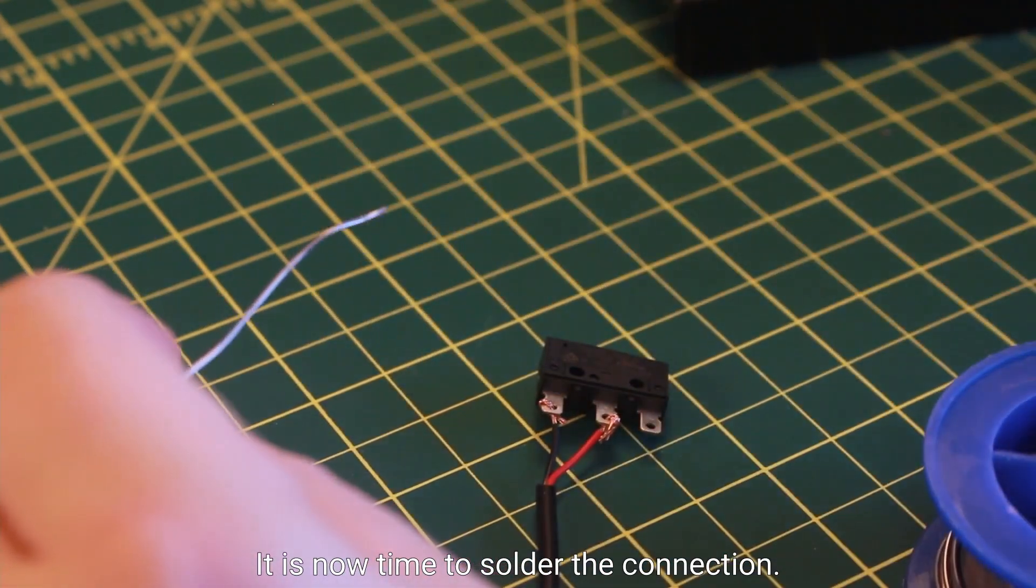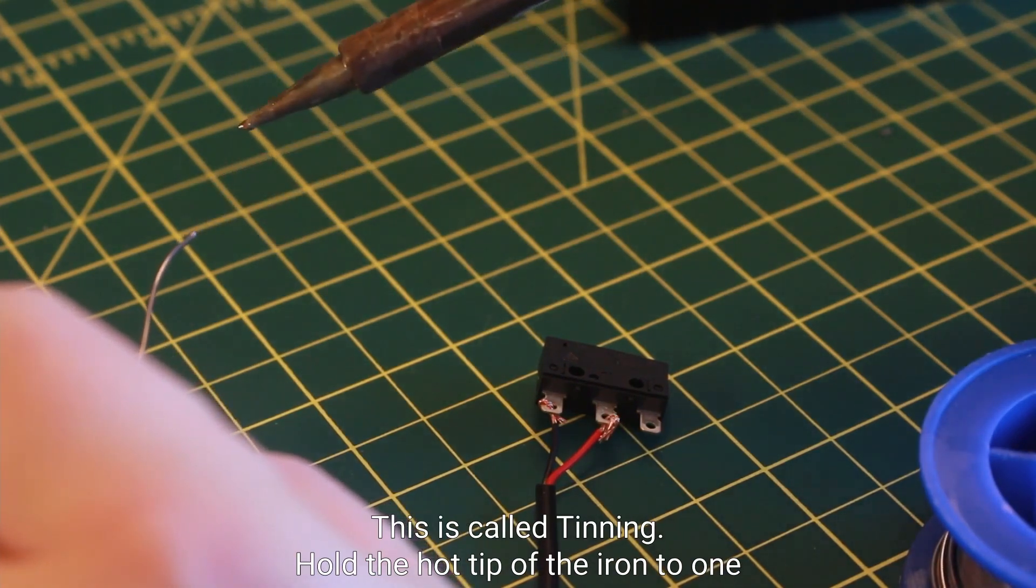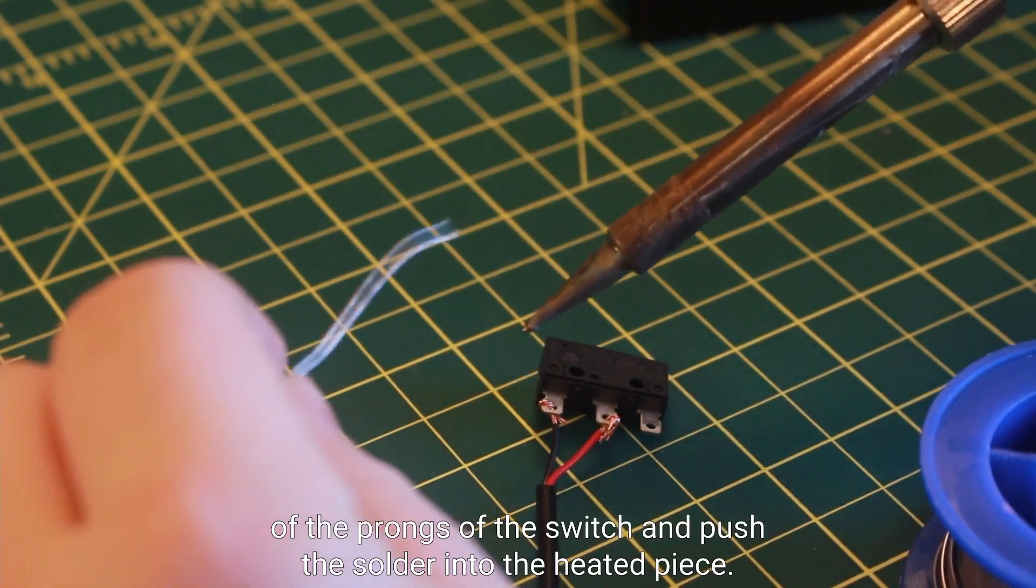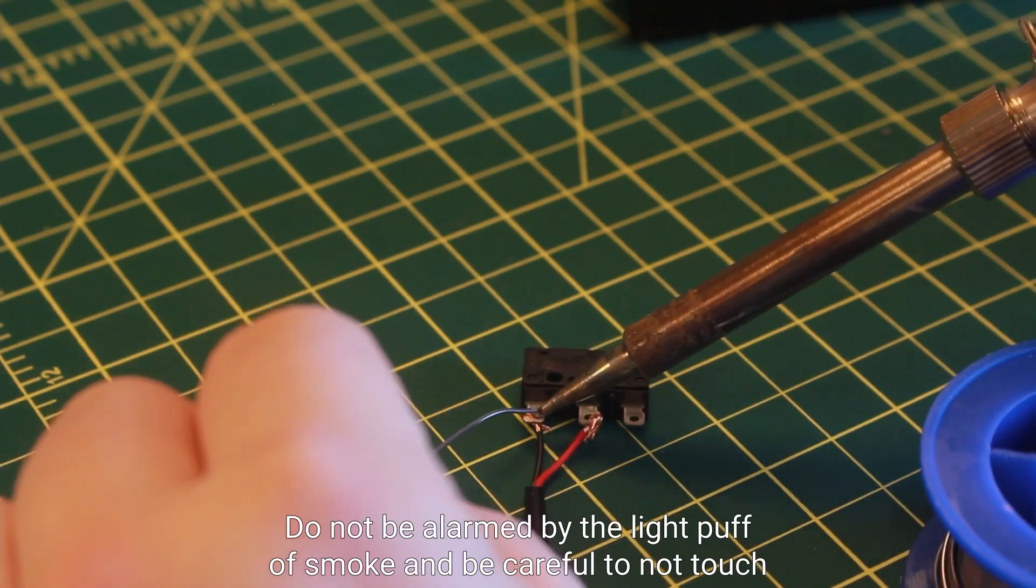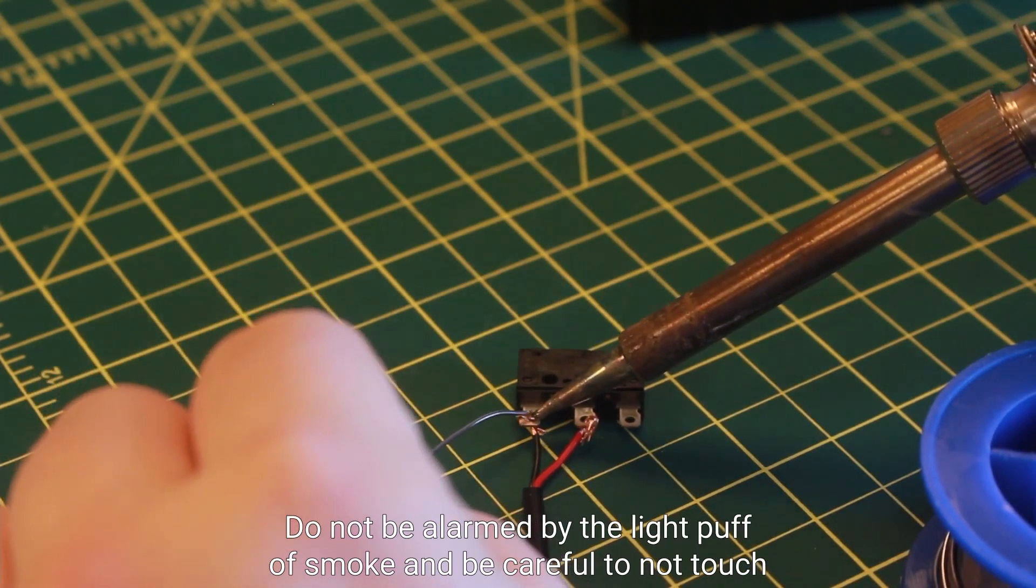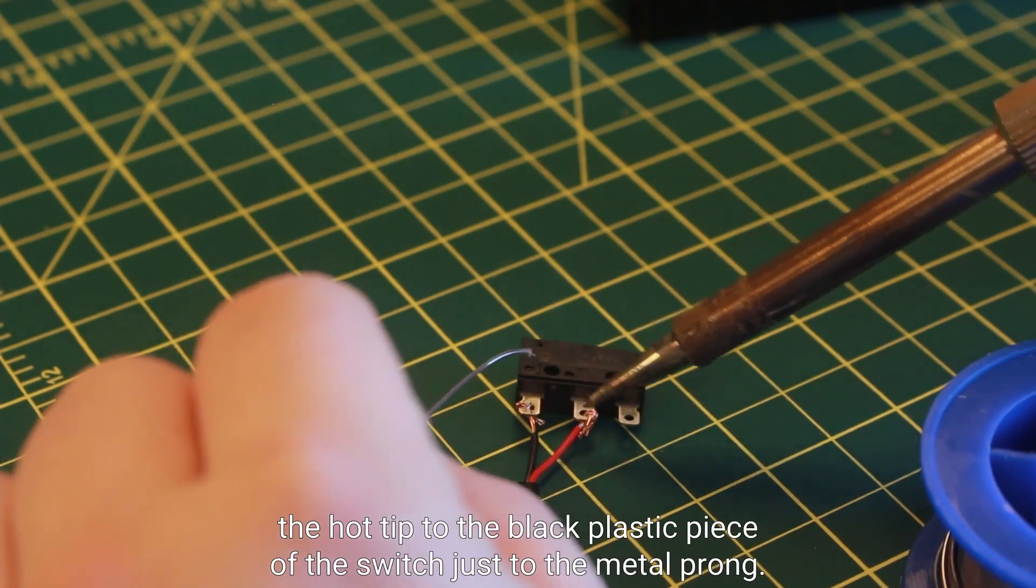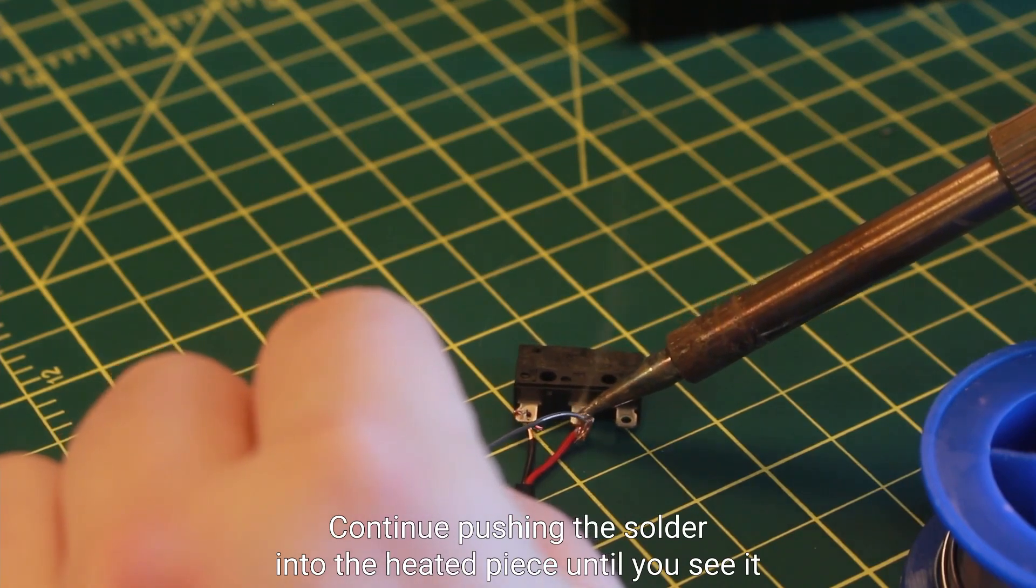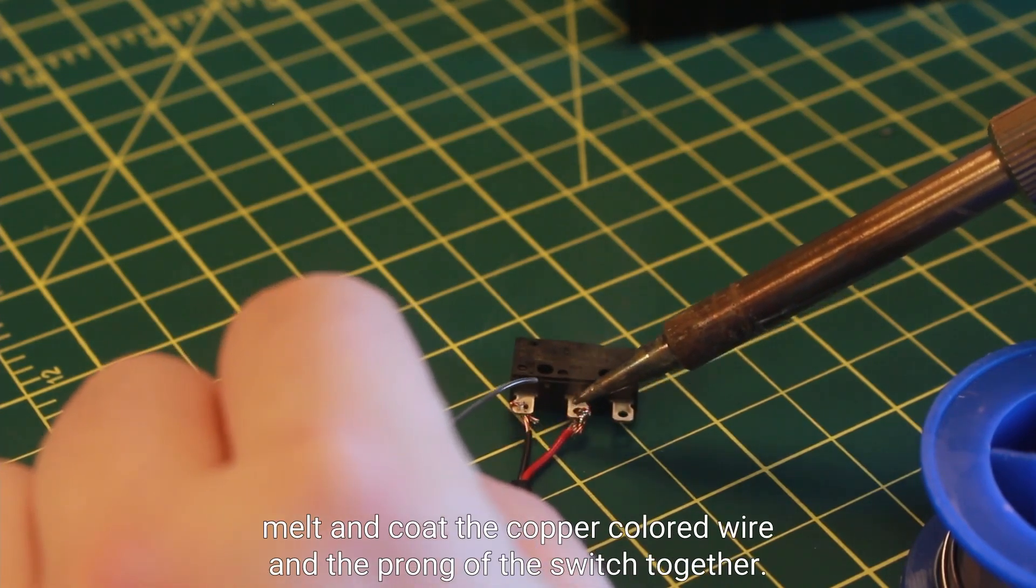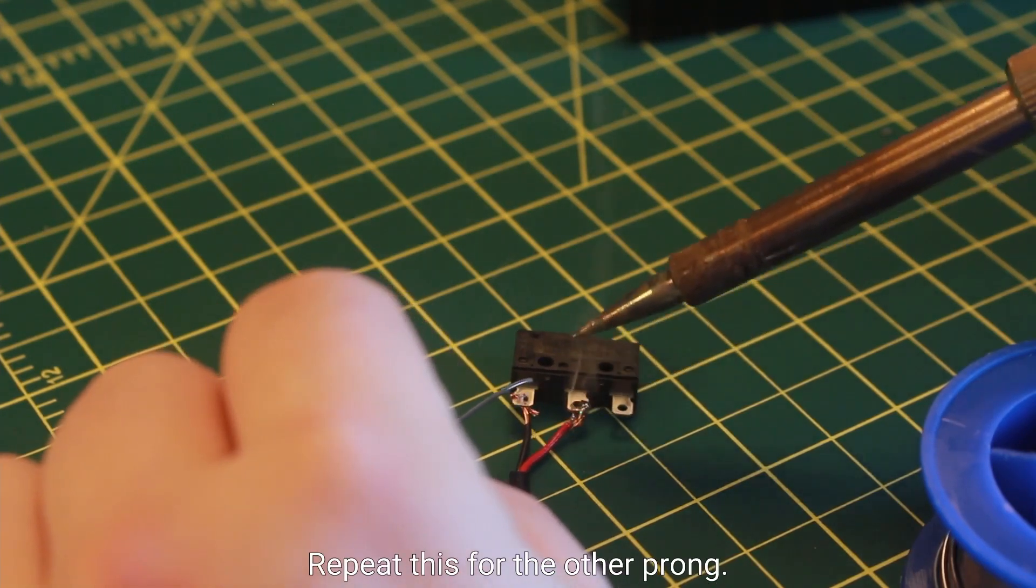It is now time to solder the connection. First take your solder and touch the tip of the iron to it briefly. This is called tinning. Hold the hot tip of the iron to one of the prongs of the switch and push the solder into the heated piece. Do not be alarmed by the light puff of smoke and be careful to not touch the hot tip to the black plastic piece of the switch, just to the metal prong. Continue pushing the solder into the heated piece until you see it melt and coat the copper colored wire and the prong of the switch together. Repeat this for the other prong.